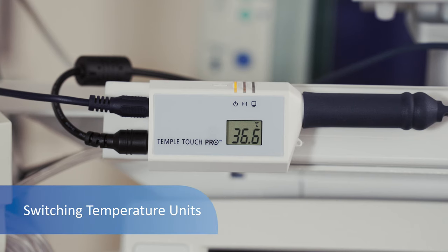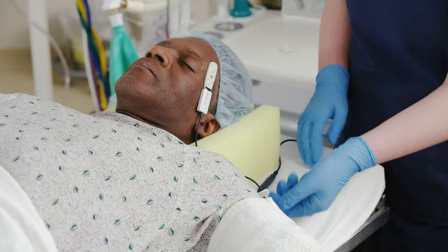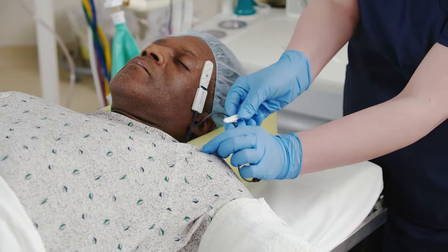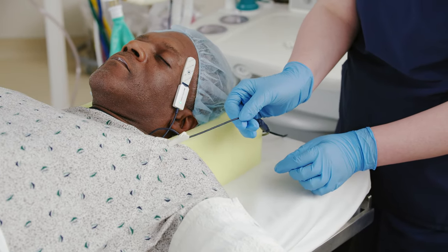The MCU and patient monitor will display temperature in Celsius or Fahrenheit within three minutes. To switch the display between Celsius and Fahrenheit, press and release the reset button. The provided clip should be used to secure the connecting cable to the patient's gown to ensure the sensor is kept in place.